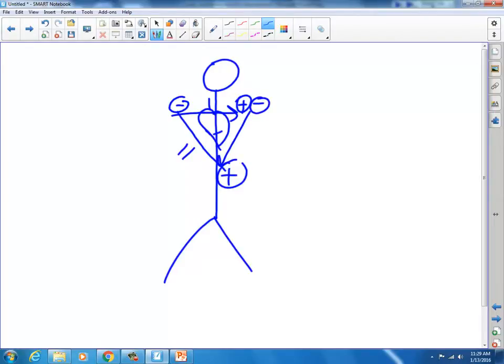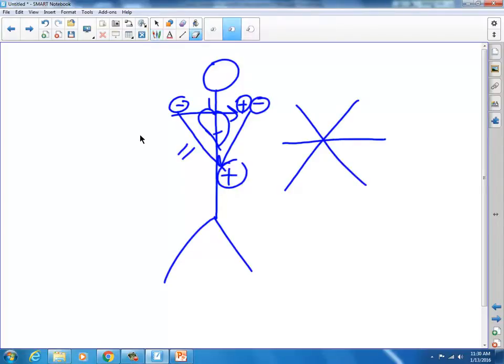So what do those axes, those points of impulse, those lines of impulse, is actually called an axis. What do they form? A triangle, right? So that's where Einthoven's triangle came in. Now, you'll see in your book, it's actually not necessarily a triangle, all right? It's more of a look like this across the heart. But to simplify it, he made it into a triangle. Okay? For you to think about that reference.